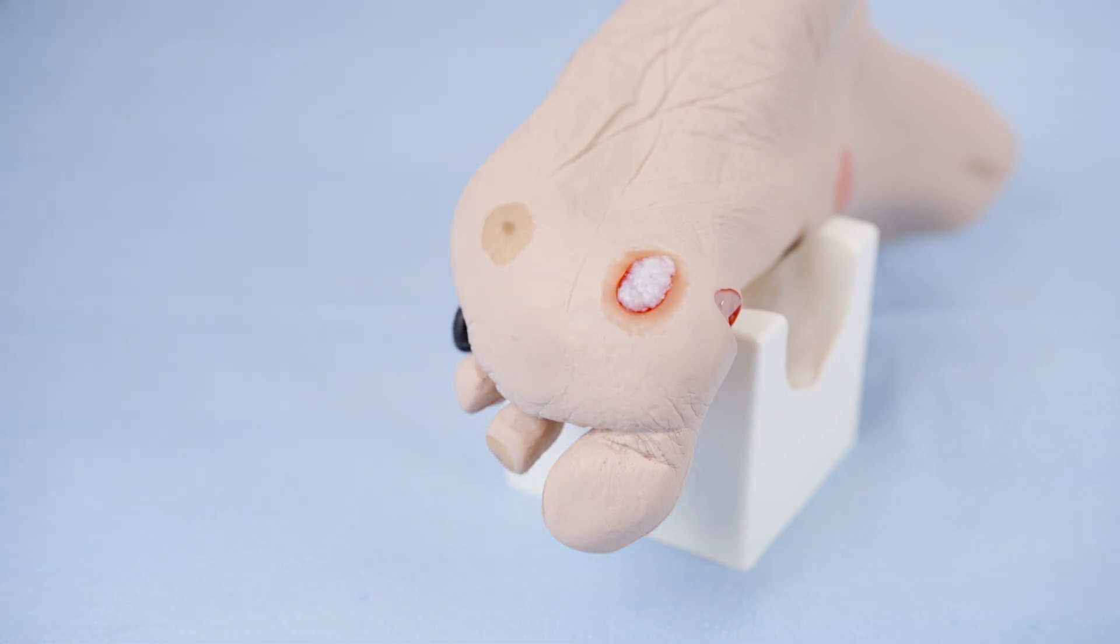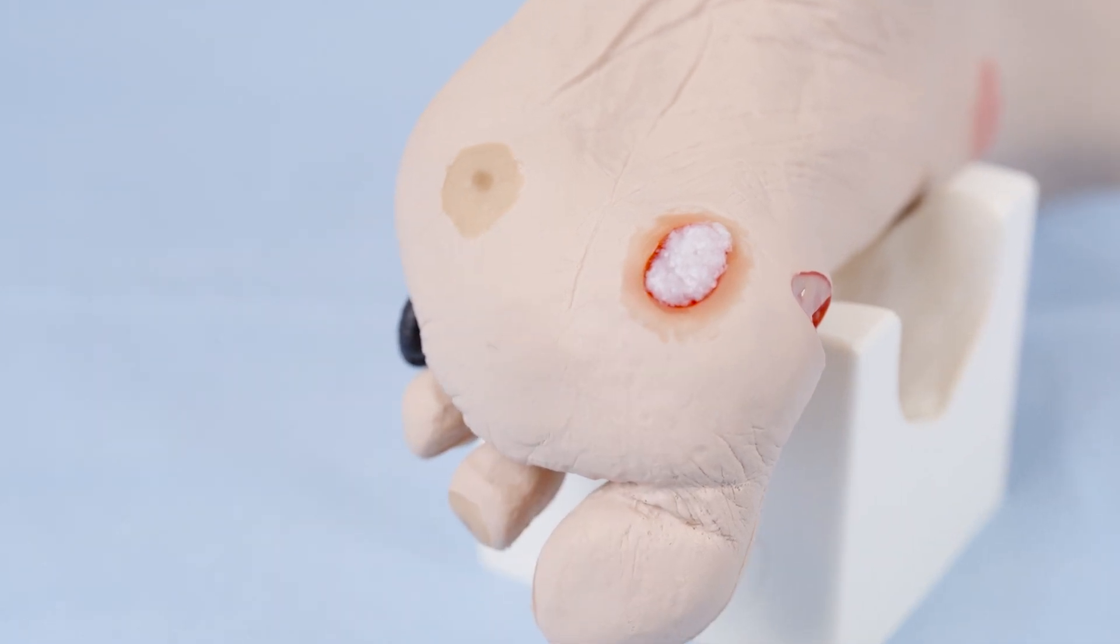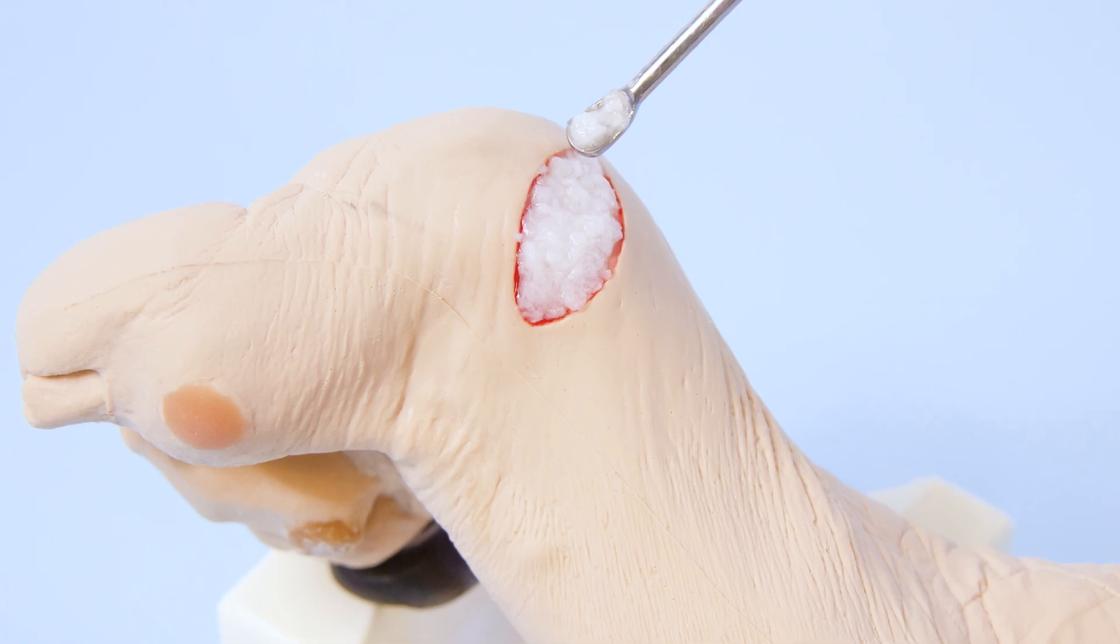If needed, use a sterile instrument to dispense particles. The device should contact the wound bed up to the wound margins. Up to 8cc of CorPlex-P may be applied per procedure.